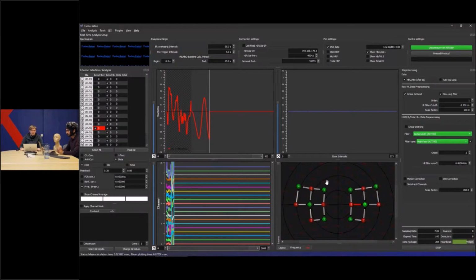He will now start NIRstim to show a basic design. So NIRstim is used to trigger specific information. Here we see the oxygenated time course and in blue the deoxygenated time course. As you can hear, now the condition left is started, and maybe he's trying to start with the finger tapping. As you can also see, the signal seems to go up.